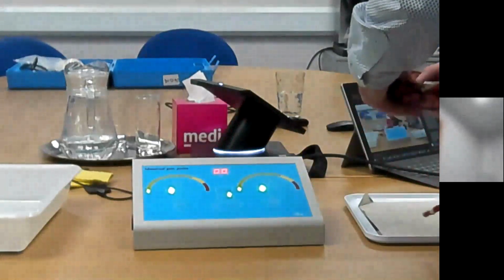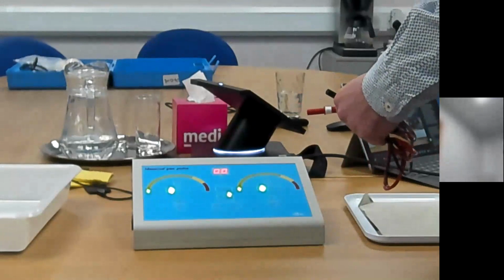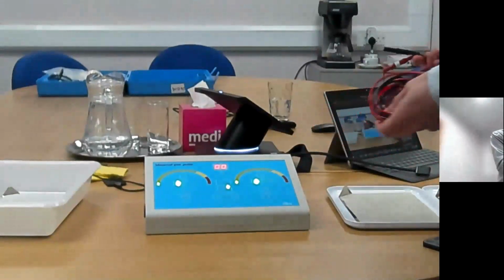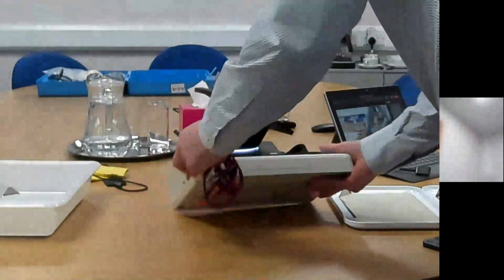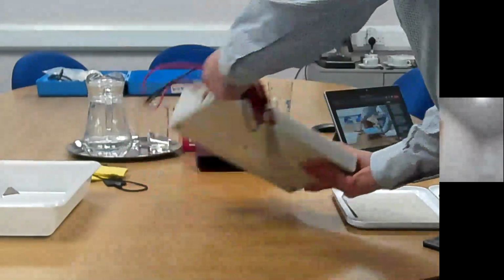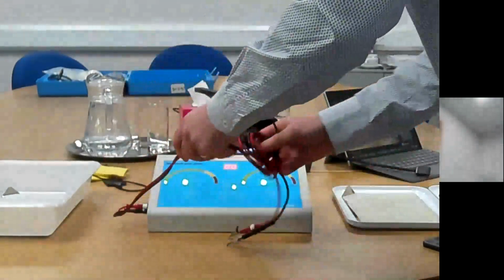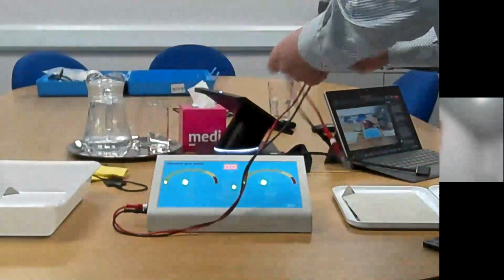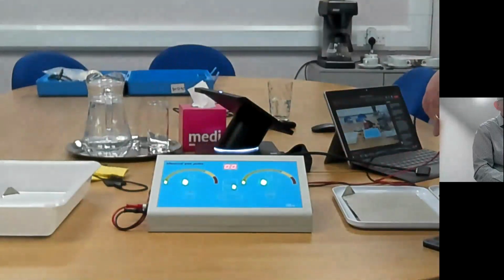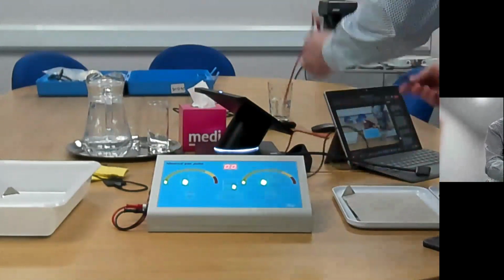So if I show you how to set up first of all, for just treating the hands, you would take the set of red and black cables, and it doesn't really matter which generator you use, but we tend to say use the left-hand side generator if you're just treating one site. You plug the red and the black cables into the red and black there. Now that's actually not essential, but it's useful to make sure you set it up the same every time, so that especially when you're treating more than one part of the body, or you're working with a colleague, you know that you've all set the machine up exactly the same.